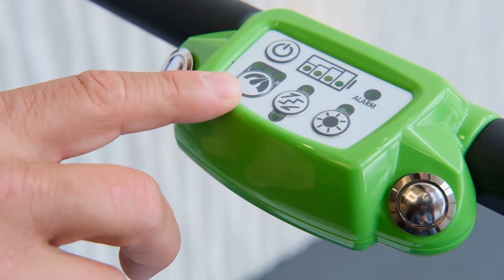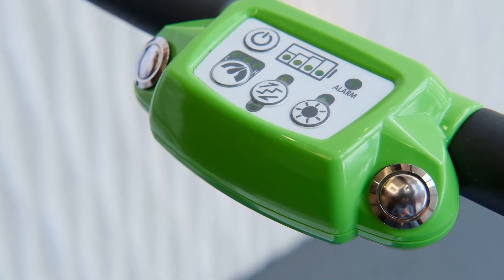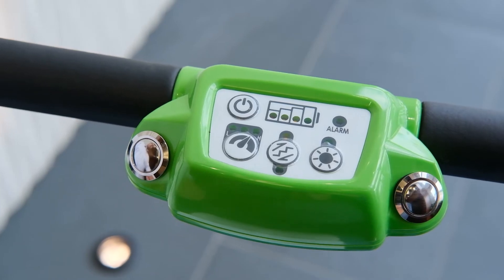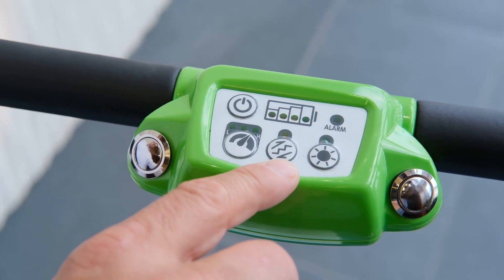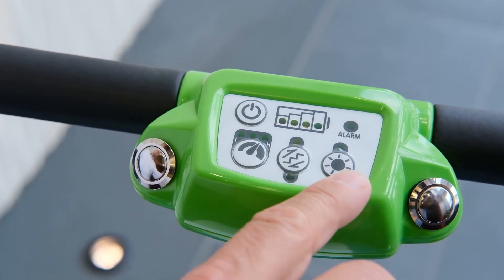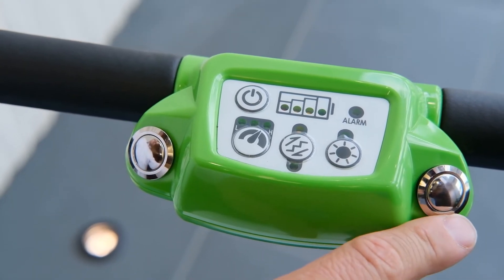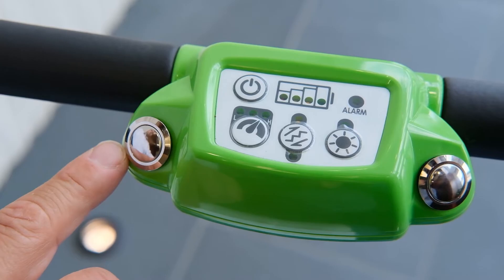This is the speed selector switch. The chair has three different speeds — start with the lowest speed and do not increase until you are comfortable. This is the direction switch; press this button to switch from ascending to descending mode. This is the LED light switch, which will turn on and off the LED guide light. These are the motor buttons; press either button to begin powering the chair.